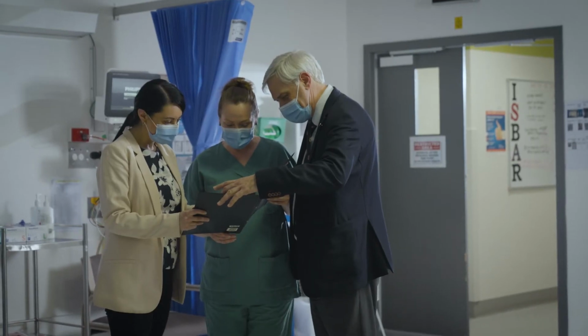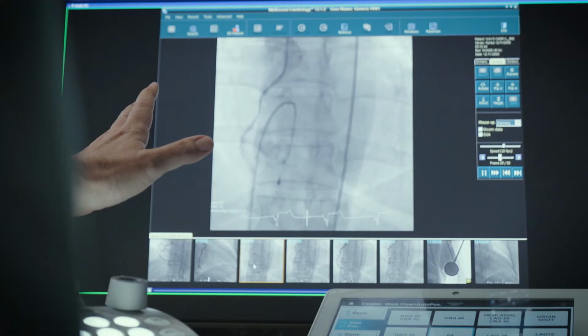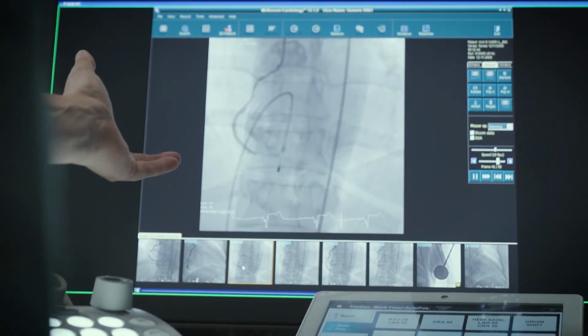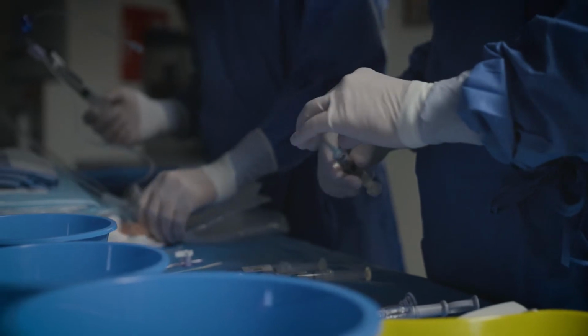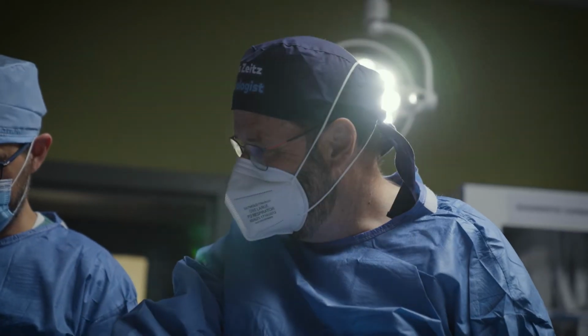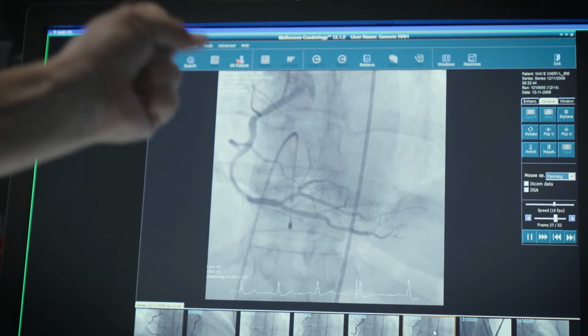So the Functional Coronary Angiography initiative builds on work we've been doing for more than 30 years and extends the typical coronary angiography, which looks at the anatomy of heart arteries, primarily looking for narrowings within the vessels, to look at the behaviour of arteries and see if they are prone to spasm, either of large vessels or small vessels. And as opposed to a normal angiogram technique, this requires provocation of those abnormalities.